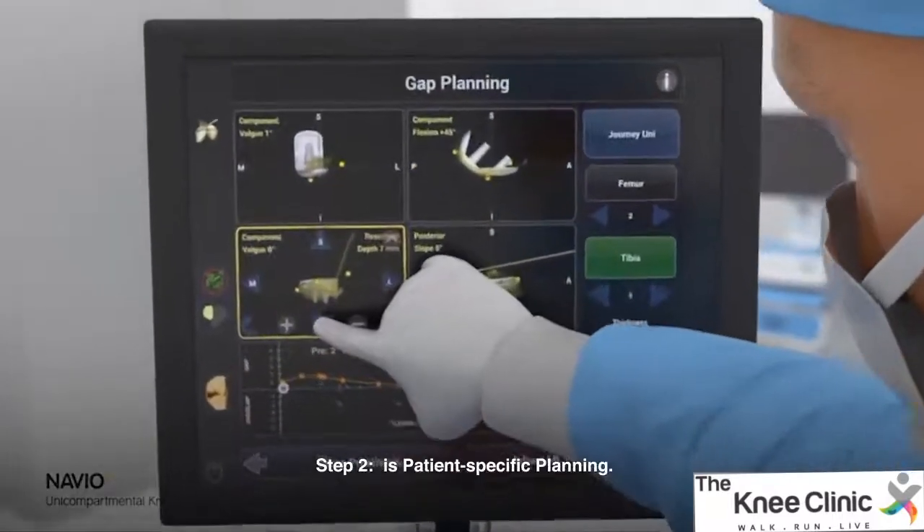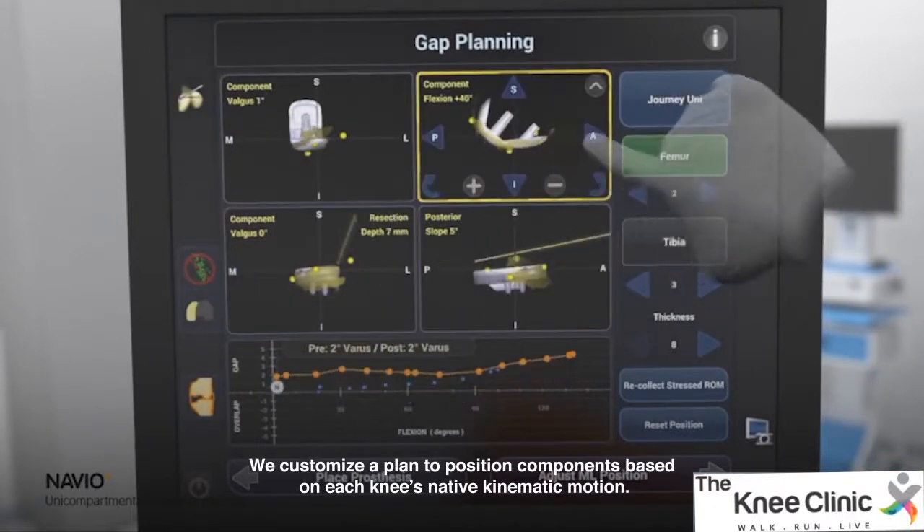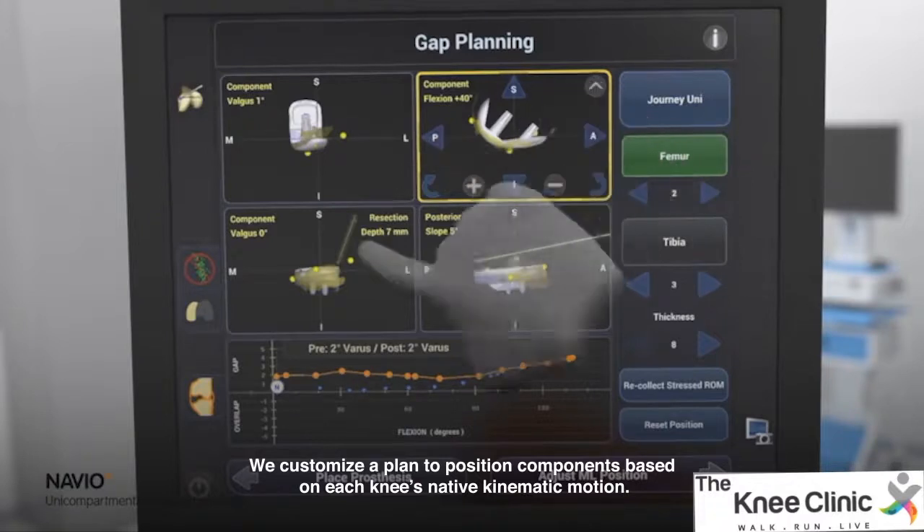Step 2 is patient-specific planning. We customize a plan to position components based on each knee's native kinematic motion.